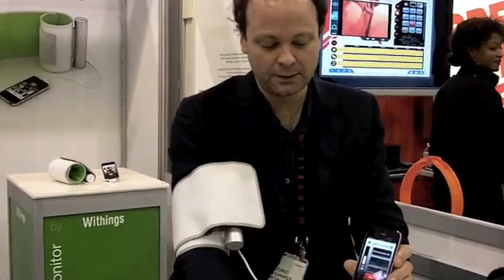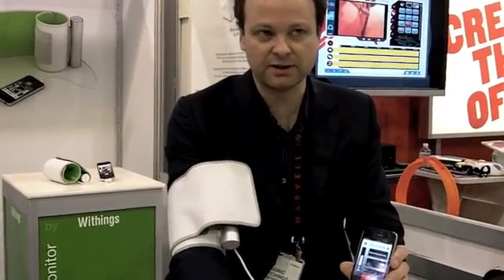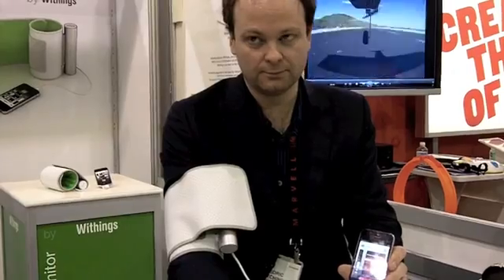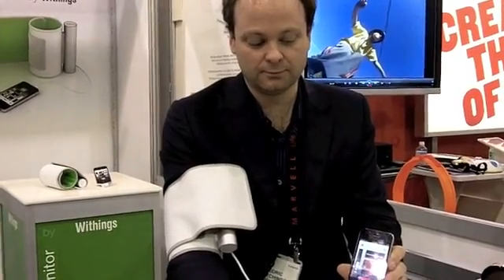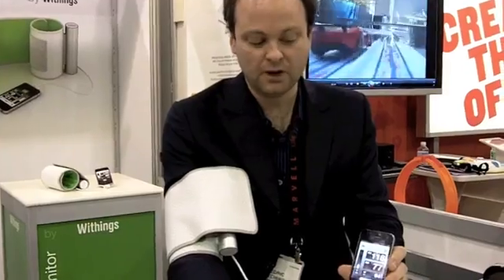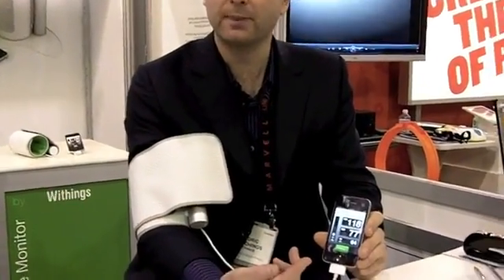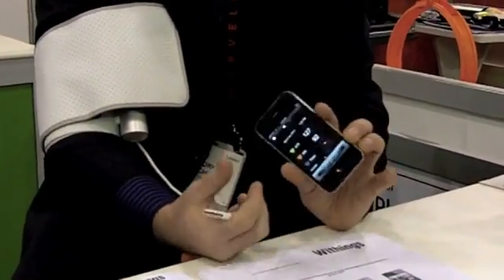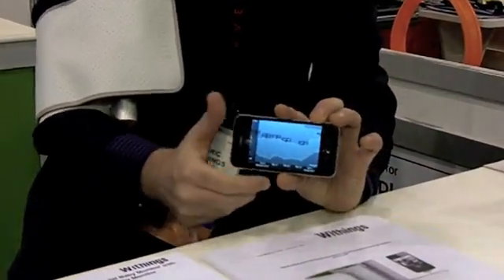We need to rest for 20 seconds while it's taking the measure. You can see it's inflating and it will start deflating. It just took my blood pressure, and most importantly it will monitor my blood pressure over the long term.